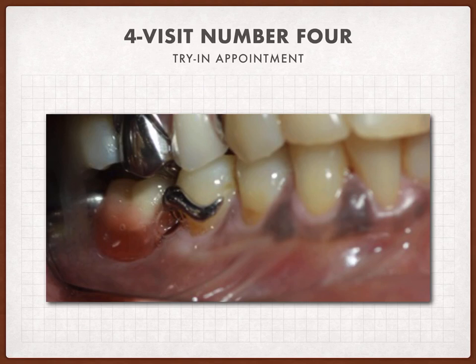The first thing is to check the vertical, horizontal and rotational relationships of the removable partial denture, and that is done by the articulating paper, checking if there is any centric or eccentric relationship impingements, or if there are any high spots or anything like that, that will indicate there is a problem in the vertical or horizontal relationships.